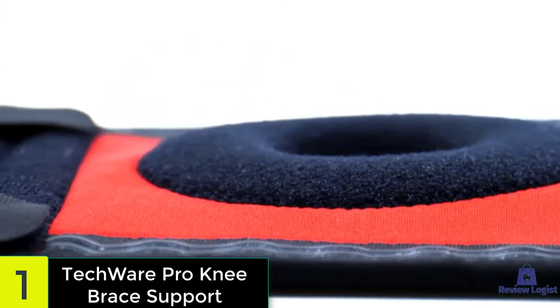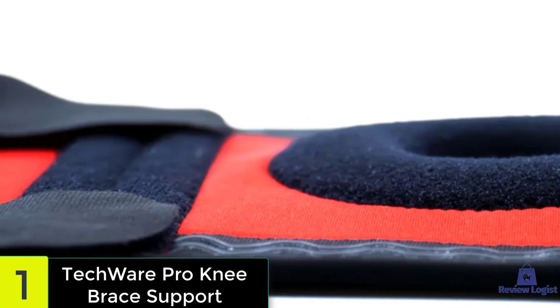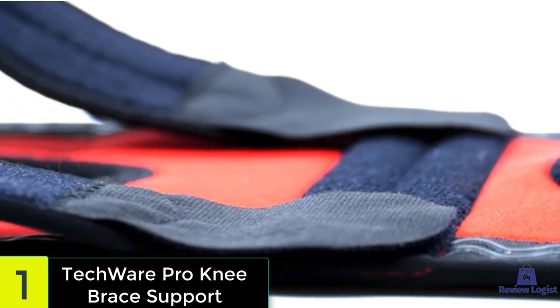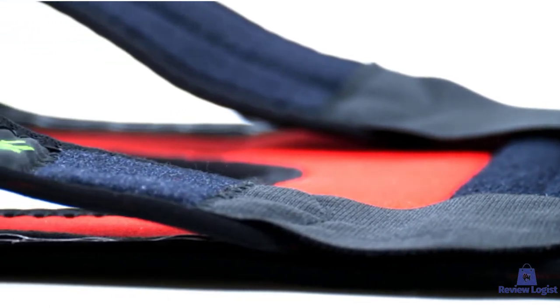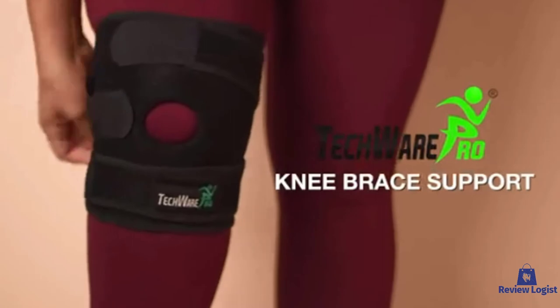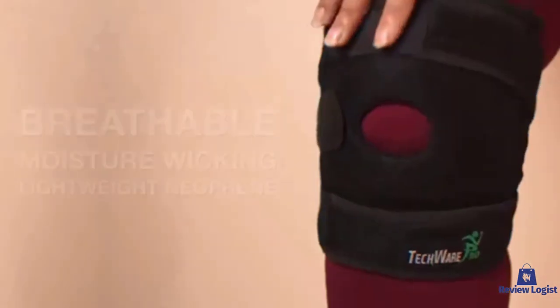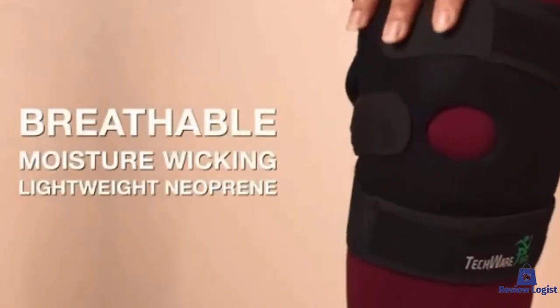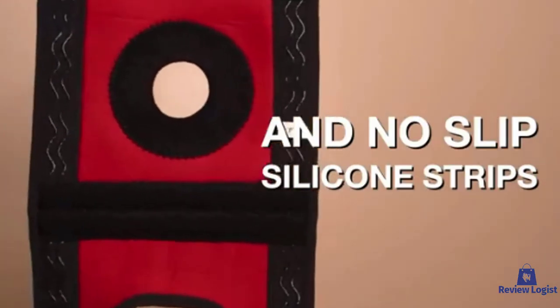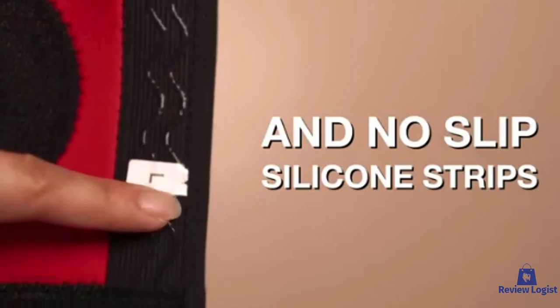While doing any physical activities it is natural to build up sweat. This product absorbs moisture and prevents your knee from sweating and developing a foul smell, due to the moisture-wicking material, and it is also effortless to clean. The brace comes in four different sizes to fit most knees, and you have an adjustable velcro strap to customize the size further. It also comes with non-slip silicone strips to ensure the brace does not move around while in use.